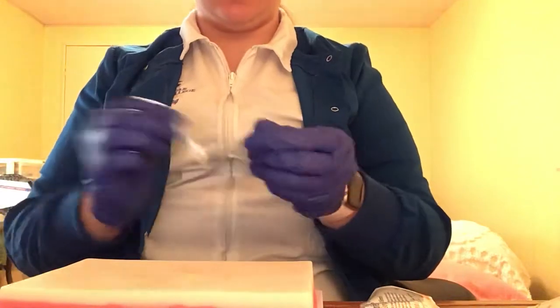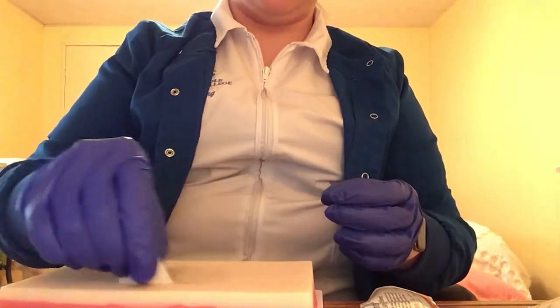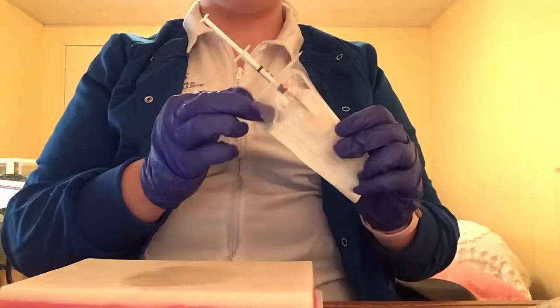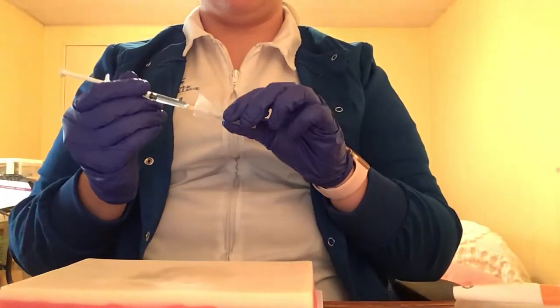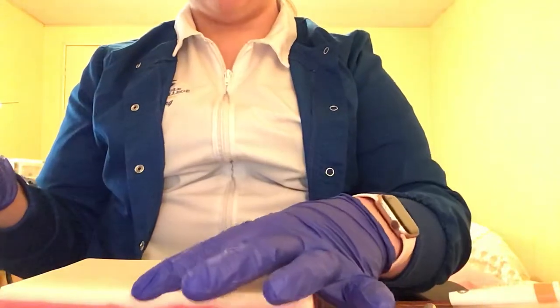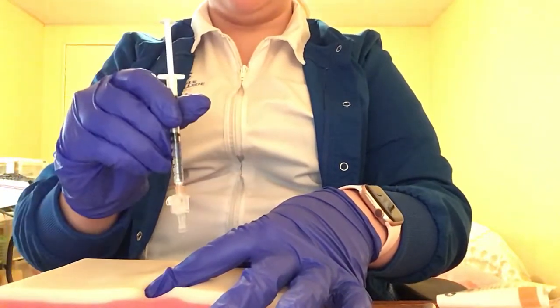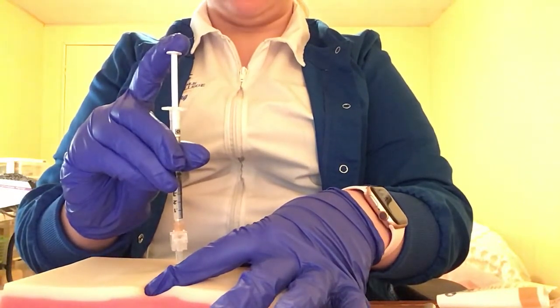And once again, I'm going to take an alcohol pad and I'm going to clean from the inside to the outside of the skin of her abdomen. We'll let that dry for about 5 to 10 seconds. I'm going to remove my needle cap. And for this one, I'm not going to use the Z-track formation. I'm actually going to pinch as best I can on this fake skin. But normally I would pinch an inch, and I would go right in the middle and shoot it down at a 90-degree angle, just like a dart, like the last one, and depress the plunger slowly.